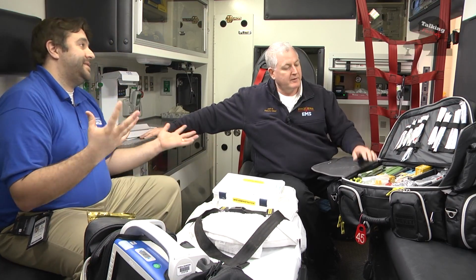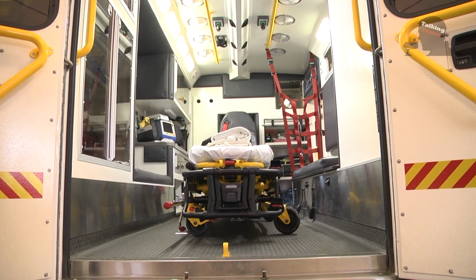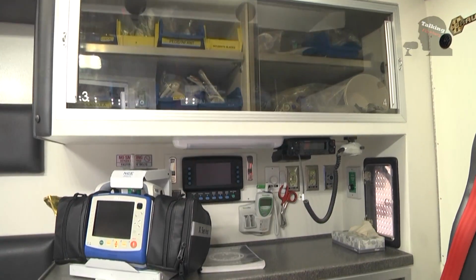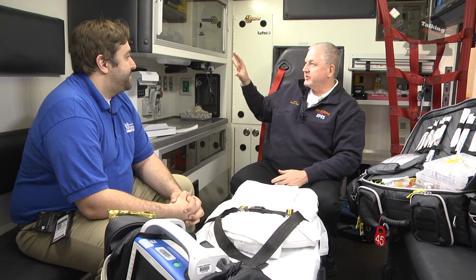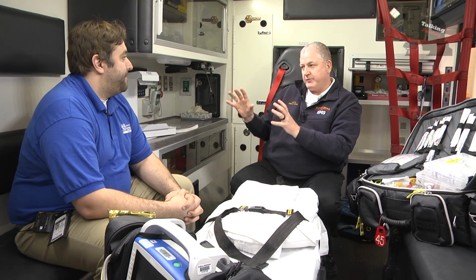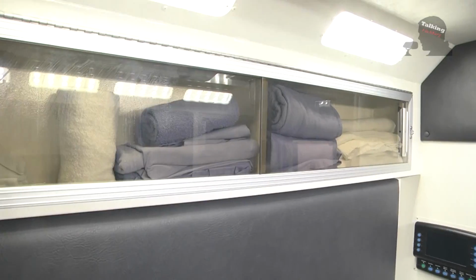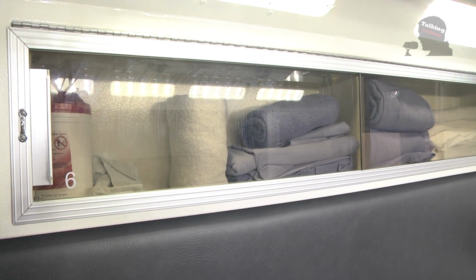All right, so going back inside the ambulance, just in general, you'll see a lot of compartments in here, and they all serve a purpose. So just in general, what are common things that are inside here at the paramedics' reach? Yep, so most of the stuff in here, I would guess most of the ambulances, even the basic life support ambulances, would have at their disposal as well. So we have blankets and pillows and stuff that are in here, some cleaning supplies when we're done.